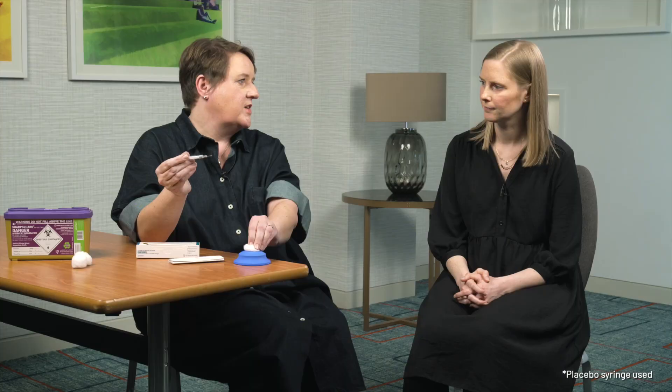Finally, do not recap the needle — just discard it into a puncture resistant container, ideally a sharps bin. Remember, you must only use each pre-filled syringe once.